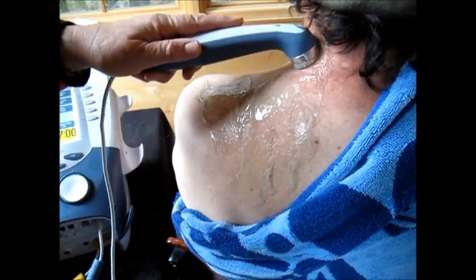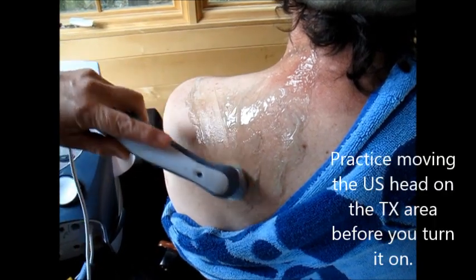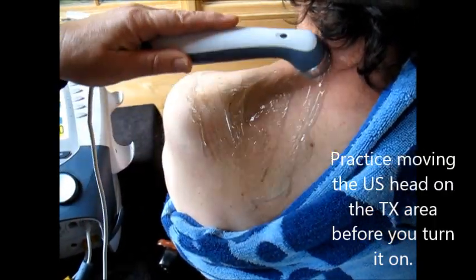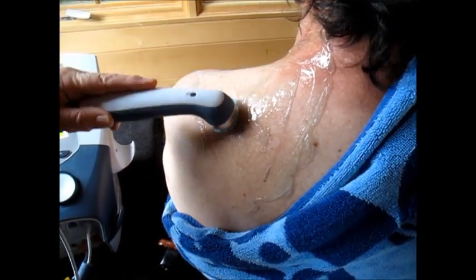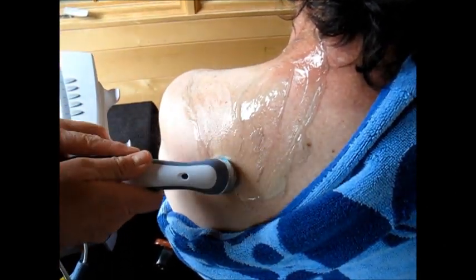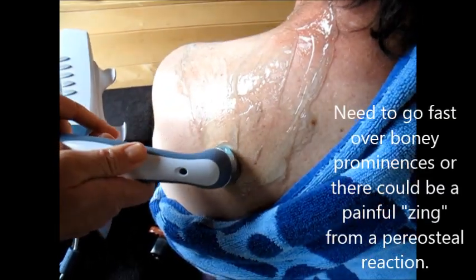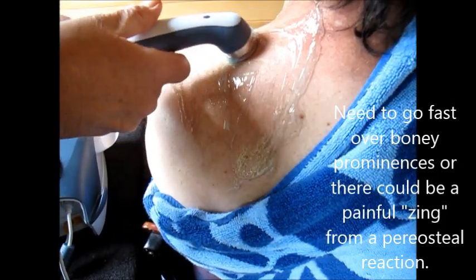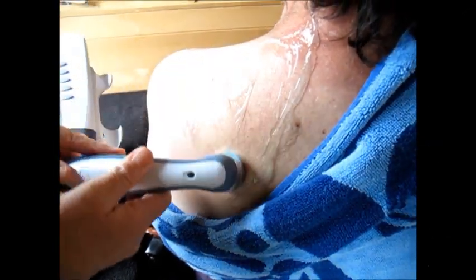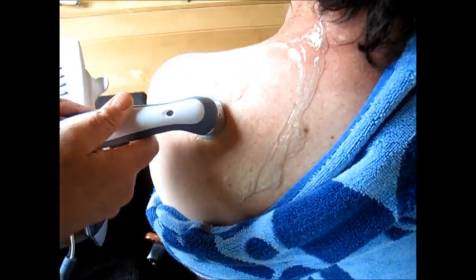What I recommend is when you're first doing ultrasound, make sure to practice with the ultrasound head a few times with it turned off on each patient. As I get right to where the scapula is, the patient is going to get a zing if I go too slowly. You want to go nice and slowly on the muscles, but as soon as you get to the scapula where there's bone, you're going to have to speed up — and that is because of the periosteal reaction.